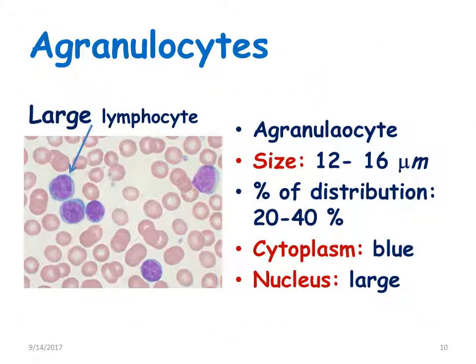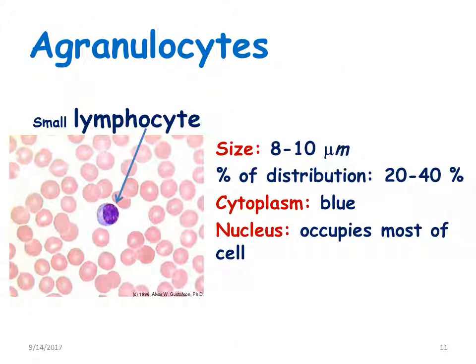Now let us look at the agranulocytes. The large lymphocyte is 12 to 16 micrometers in diameter. The percentage distribution for all lymphocytes together is 20 to 40%. Cytoplasm is blue in color with a single large nucleus. The small lymphocyte is 8 to 10 microns in diameter, with the same percentage distribution of 20 to 40%. Normally we don't differentiate between large and small lymphocytes — together they are considered as lymphocytes. The nucleus occupies most of the cell.